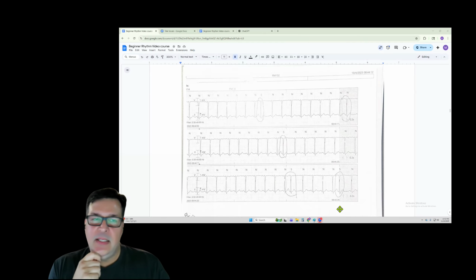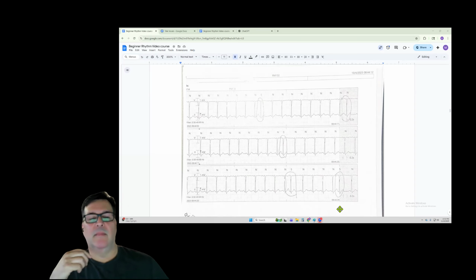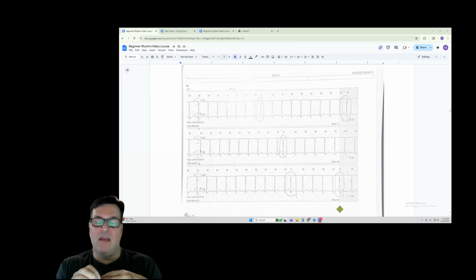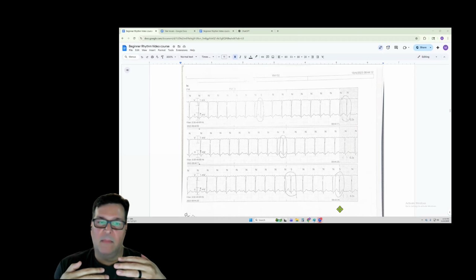So these rhythms that we've talked about, they're pacemaker cells. The SA node is a pacemaker cell. This atrial ectopic rhythm is a competing pacemaker cell, where it's not waiting for the SA node to fire or the heart rate slowing, it's taking over. So they're competing pacemaker cells. And I'm emphasizing this because there's a difference between pacemaker cells and excited cells.